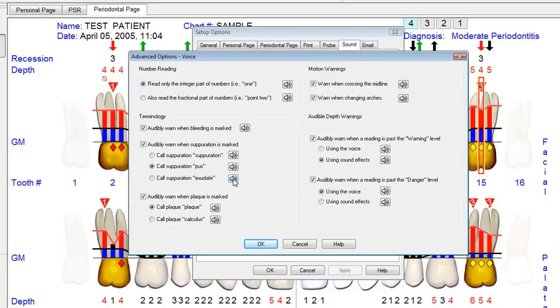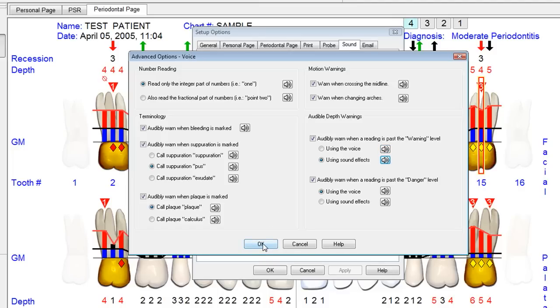So if you want to call suppuration 'pus' or 'exudate,' you could simply change the radio button to select the specific voice file you want to use. You could turn off a particular sound, or test different indicators of disease.